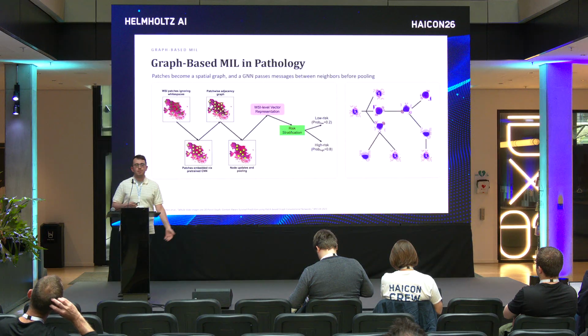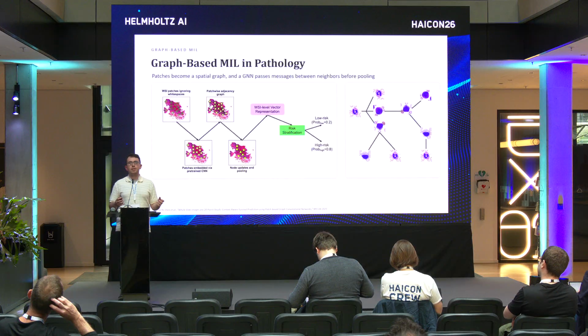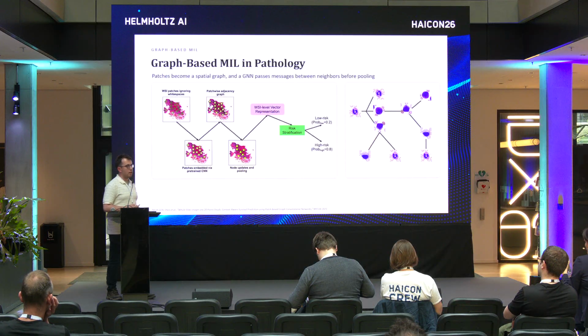Because in theory, in a transformer, you can model it because you have to calculate self-attention between all pairs. But there are a lot of redundant healthy cells. Therefore, the real cell-cell interaction for the disease is not really modeled. The best data structure to model this is to use a graph and a graph neural network.